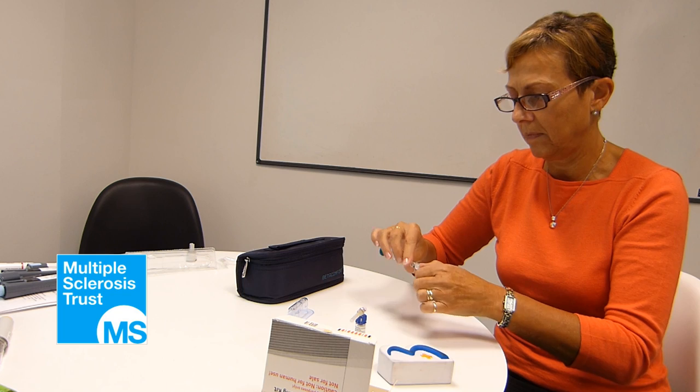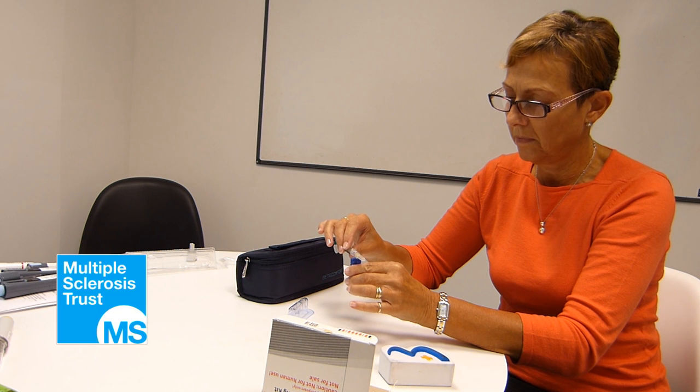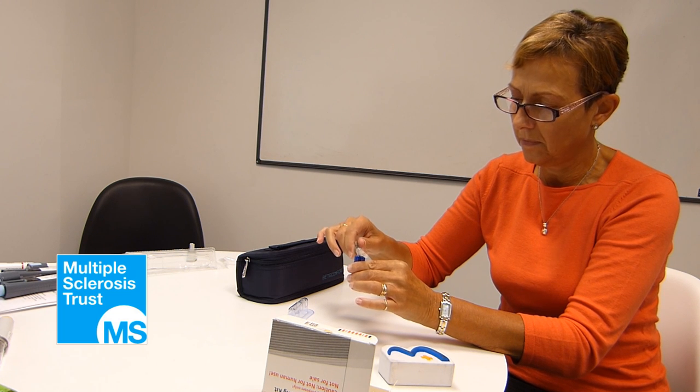Twist the orange cap to remove it from the syringe. Push the syringe onto the adapter and screw together like a screwdriver. The connection should feel secure.